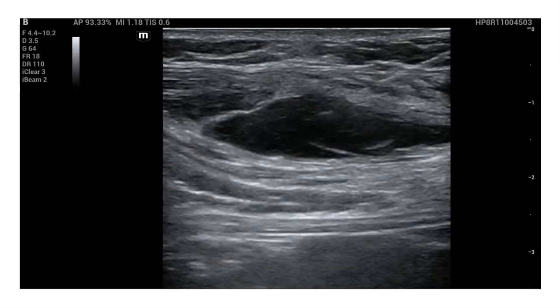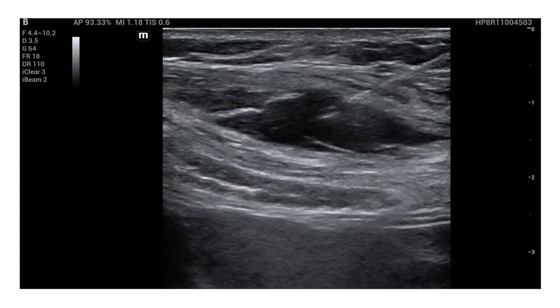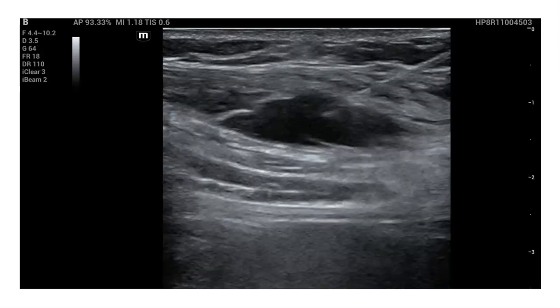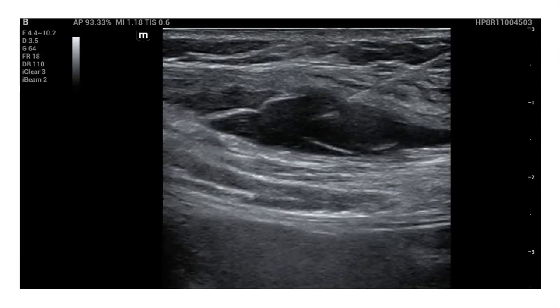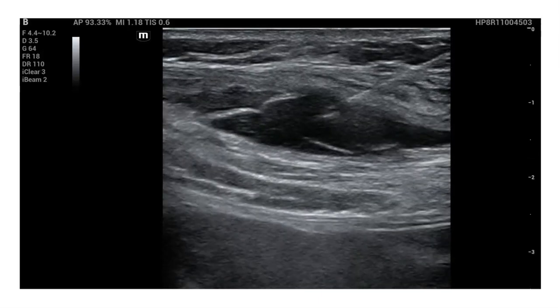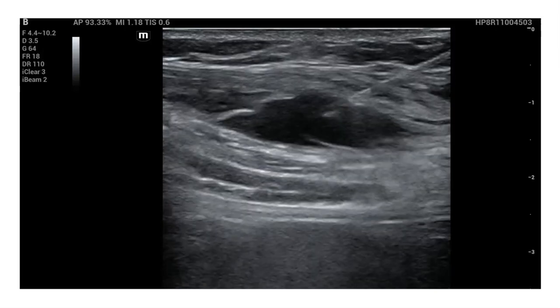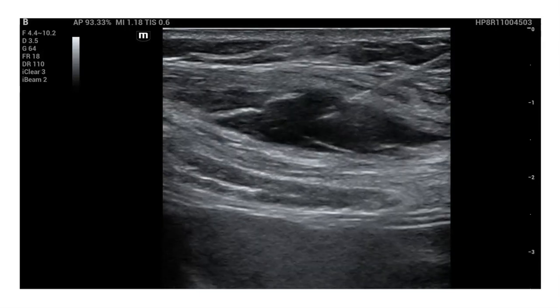Usually when I'm doing this procedure, I'll initially have my needle hooked up to a saline syringe. I'll insert my needle, and when I think I'm in the right plane, I'll have my second operator inject one to two cc's of saline. That saline injection will cause some hydrodissection of the tissues and help me differentiate whether my needle is still within one of the muscles — where we'd see separation of the muscle fibers bounded within the muscle — versus whether the needle is within the fascia, where we would see this sort of unzipping. If my needle is within one of the muscles, I'll make a minor adjustment, inject saline again, and once I know I'm in the correct fascial plane, I'll have my second operator switch to the medication syringe and inject. Doing those first steps with saline rather than medication means you're not using up any medication just identifying the correct fascial plane.